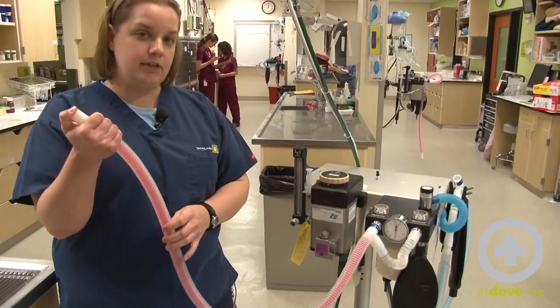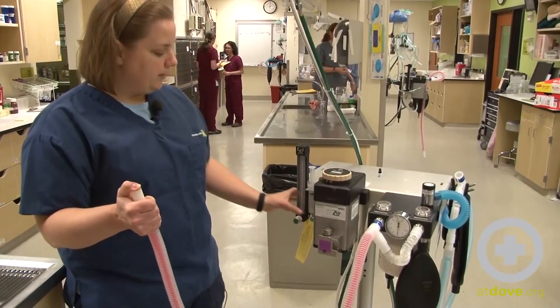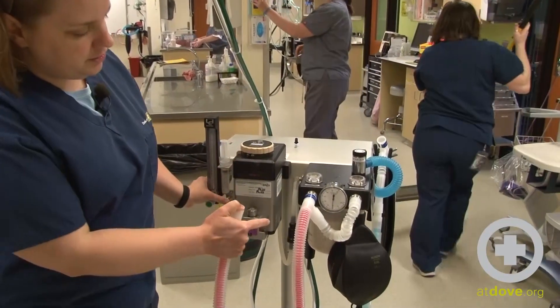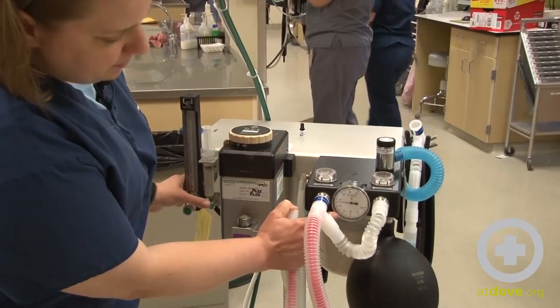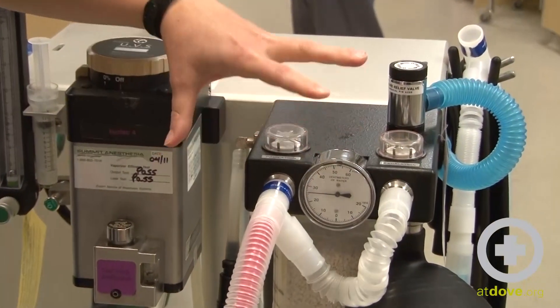You're going to need to occlude the end of your anesthetic tubing either with your thumb or with the palm of your hand, and then find your O2 flush valve. You want to flush oxygen into the system until your manometer reads about 20 centimeters of water, and then you just want to hold and watch that.